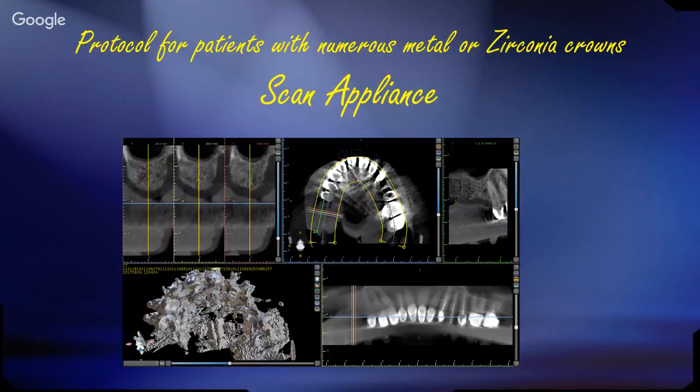So moving on, one of the questions I get quite often, and from students that we've trained on guided surgery, they'll send us a CBCT to look at, and it looks like what you see down here in the three-dimensional view. You see all this X-ray scatter, and they want to know, well, how can we make a defined scan and merge it and get an accurate guide? So there are several ways of doing this, but mostly they require doing something called a scan appliance. And previously we had to have these made in a laboratory. Well, I've developed a technique here, which I'm going to share, which is using something that every dentist already has in their practice, which is typically vinyl polysiloxane impression material and plastic trays.